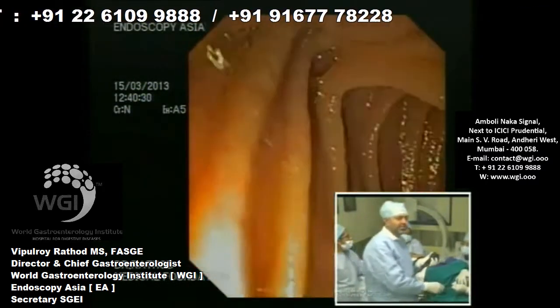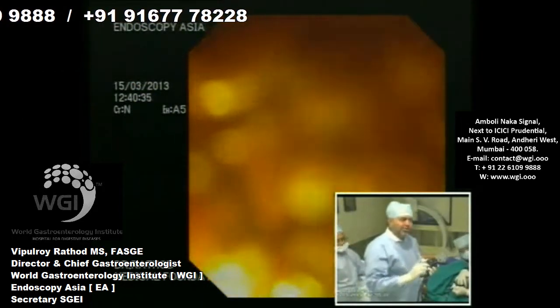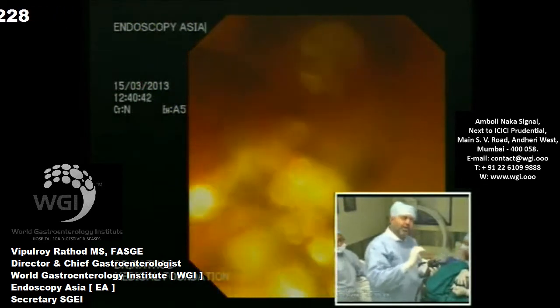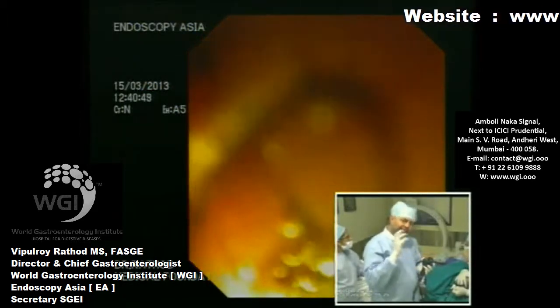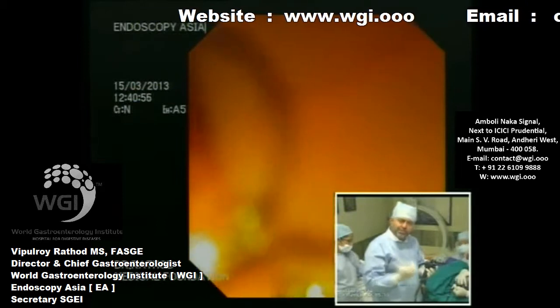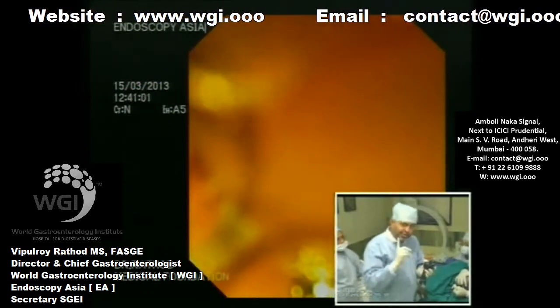Now, according to the Japanese criteria of autoimmune pancreatitis, they also recommend an ampullary biopsy. So what we do sometimes, if the patient has severe cholestatic symptoms, is EUS with FNAB, then ERC, do a biliary sphincterotomy, and put in a stent. At the same time, we'll do an ampullary biopsy. So we have the ampullary biopsy to give a histological diagnosis of lymphoplasmacytic infiltrate, as well as EUS-guided FNA-B and not FNA-C.